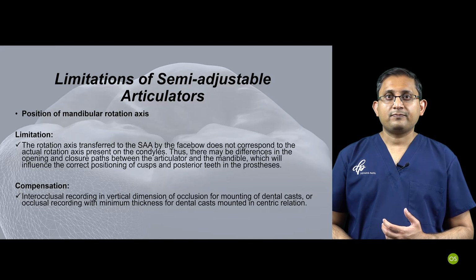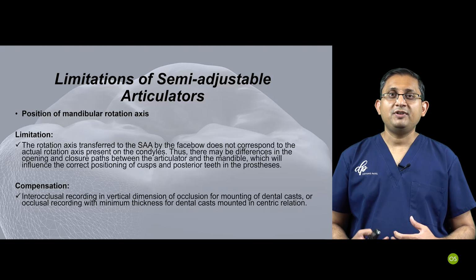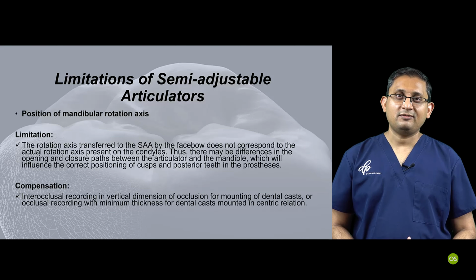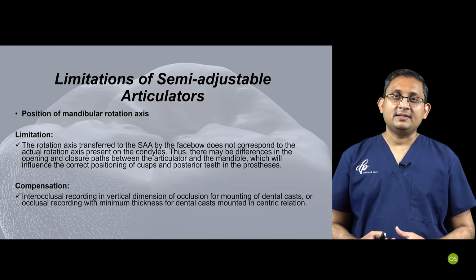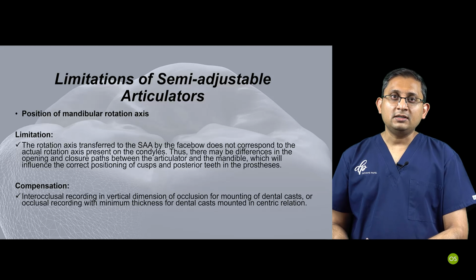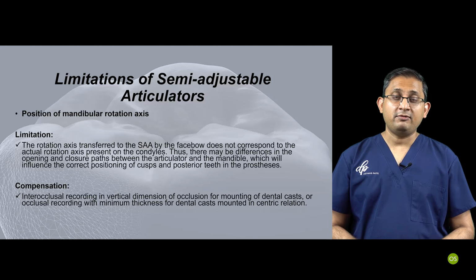Now, once we understand the limitations of the semi-adjustable articulator, we try and negate those limitations by applying mitigation factors. And I hope this is useful for you to understand why you shouldn't rely 100% on just the semi-adjustable articulator. All the other steps leading to mounting are also very, very crucial.